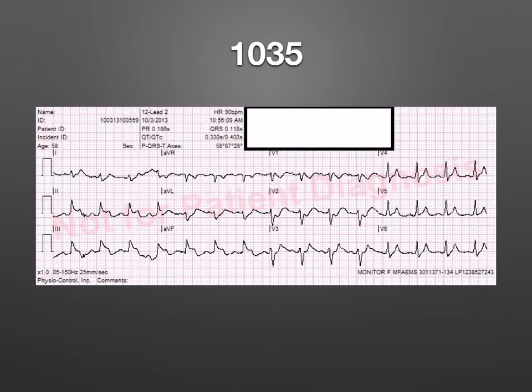Is he having chest pain? Well, at this point, I'm pretty sure if he could talk without the ET tube in his mouth, he would clearly tell you his chest hurt, if for no other reason than we were jumping up and down on it. So a post-ROSC patient with this ECG, I think it's entirely appropriate to call code STEMI on.